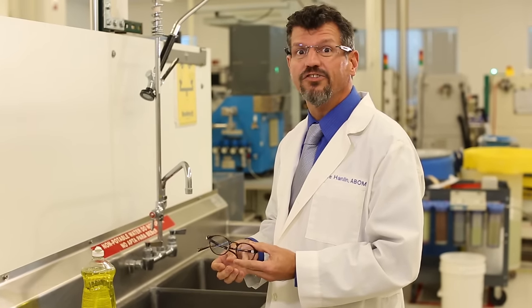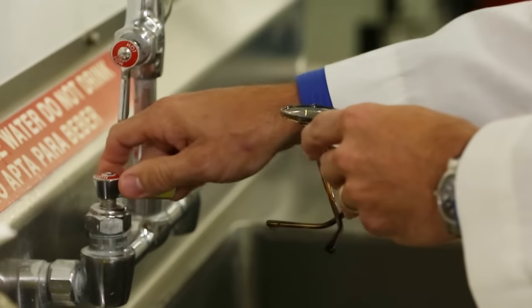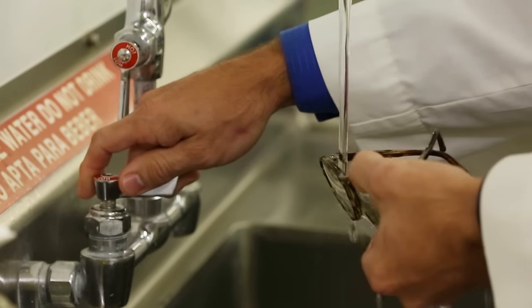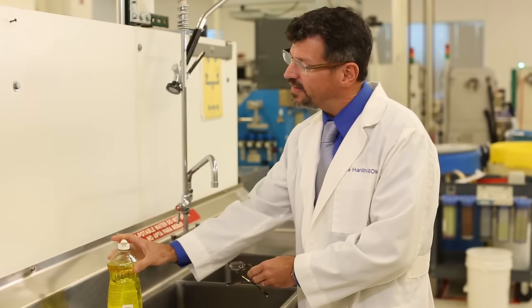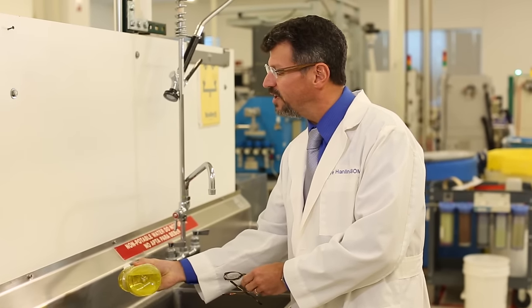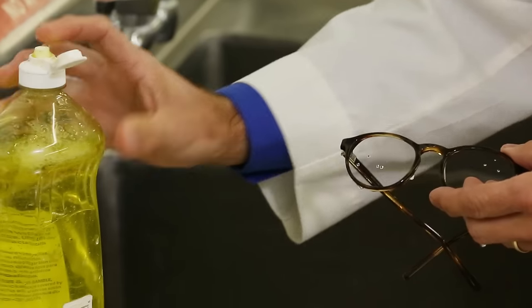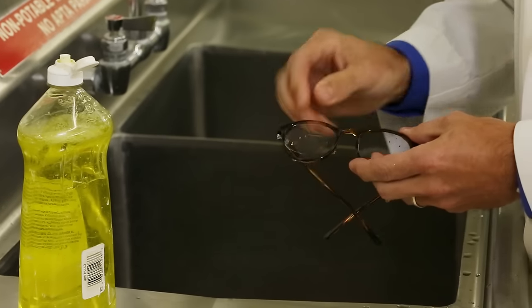First thing you want to do is run your glasses under some warm water. Then you want to take some dish soap. Preferably you want dish soap that doesn't have any skin softeners in there because that can leave a residue on your lenses.